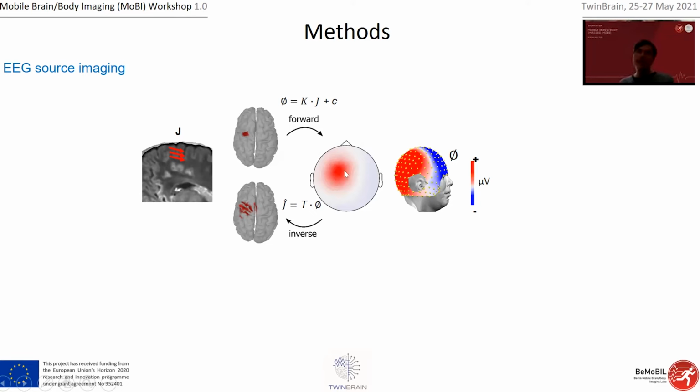If you just have, let's say, 64 channels and you want to know 5,000 points in the brain which might produce the scalp potential of 64 channels, then you have a mismatch in dimensionality, meaning you want to know more signals than you recorded, right? And you also want to know the source of an effect, because the scalp potentials are the effect of the brain sources, but you just have the effect when you want to reconstruct the sources.